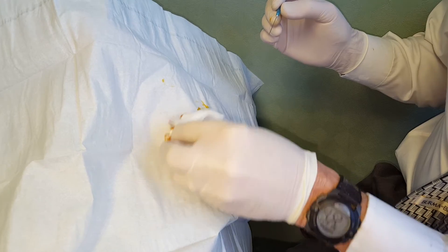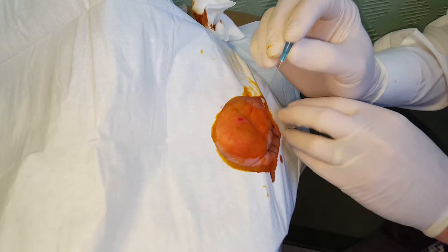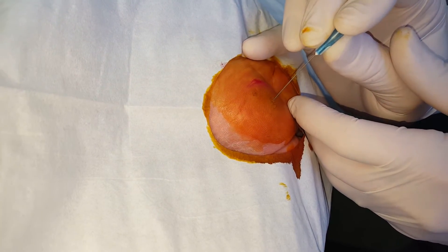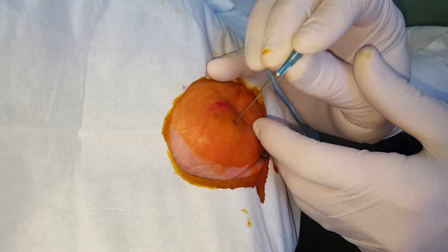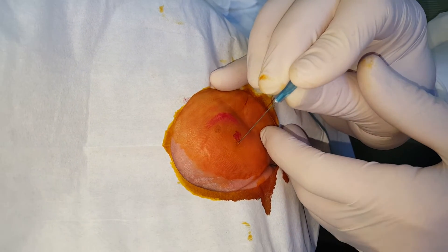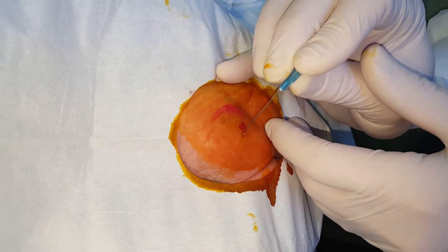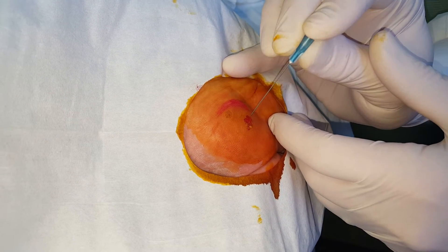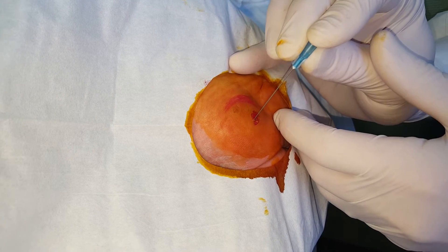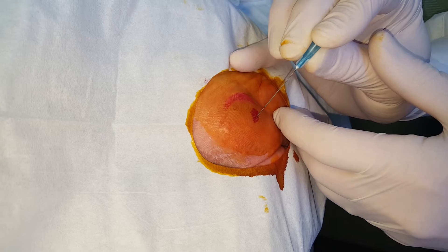We've painted this with Betadyne and put a fenestrated drape on. We're going to do the needling procedure. The technique: I'm going to needle each of these, going down until we get bleeding. Do the big one first. Since we've got the whole area anesthetized, I'll go and do the other two also.